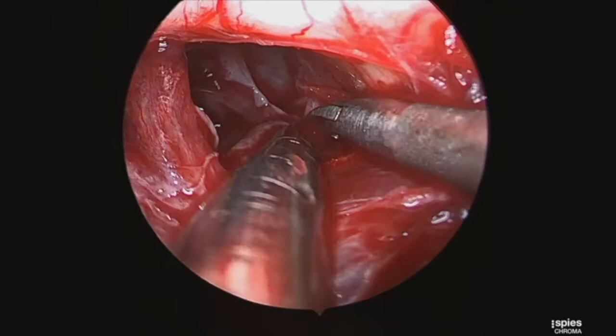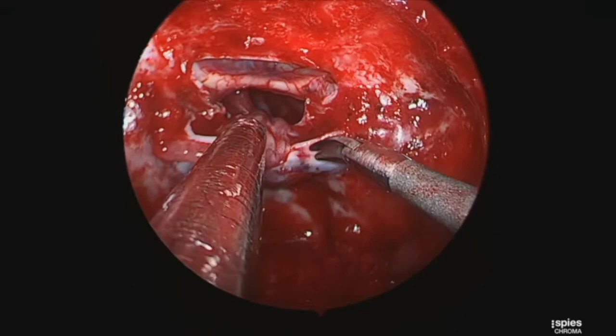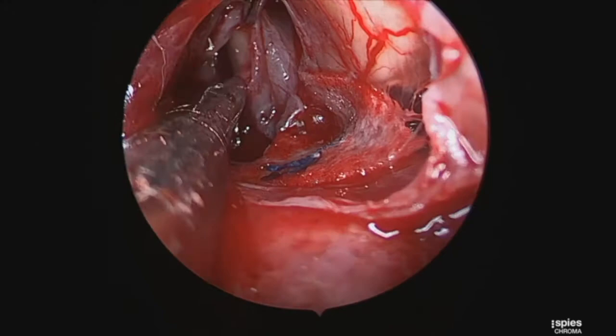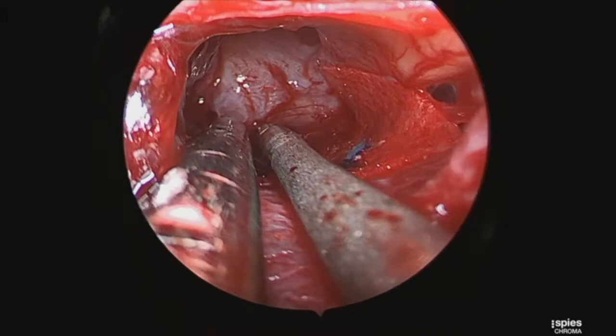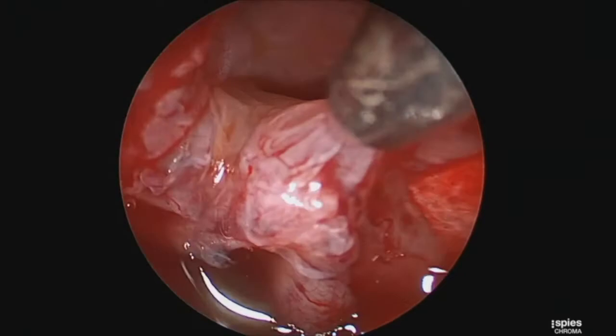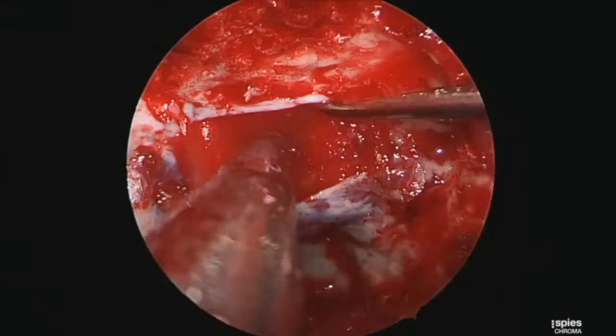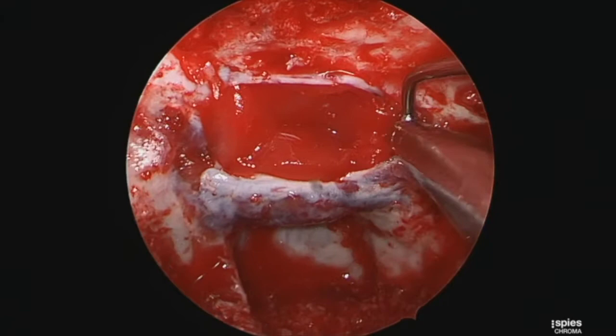The residual capsule extends up onto the floor of the third ventricle, as seen on the CT scan. Once the portion that is easily separable is dissected free, sharp dissection is used to transect the region where it contacts the hypothalamus. Care must be taken not to pull tumor capsule from the hypothalamus, as this could lead to hypothalamic injury. Instead, the endoscope is brought into the suprasellar space, and careful sharp dissection of this margin with the hypothalamus and the stalk is performed. Here we can see the last remnant coming up onto the floor of the third ventricle, which appears inseparable from the hypothalamus and appears to be merely thickened arachnoid capsule.